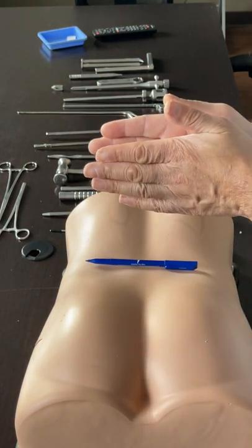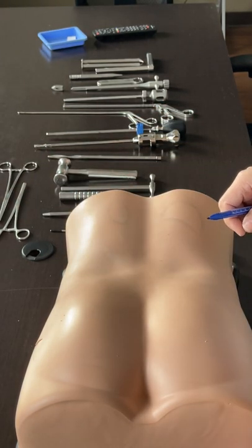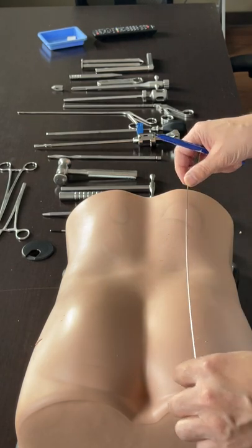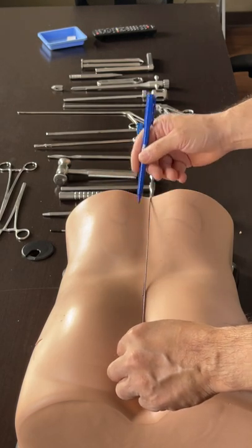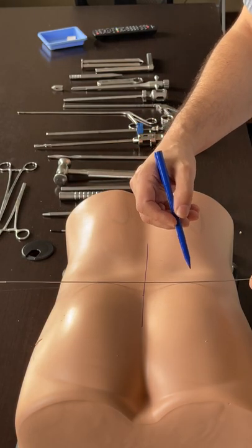It doesn't matter if it's not perpendicular to the disc, but you have to be able to see the trajectory of the disc. Even if the patient has previous scars and so on, I always get a true AP, and mark it in the AP, and then I get the trajectory of the disc.